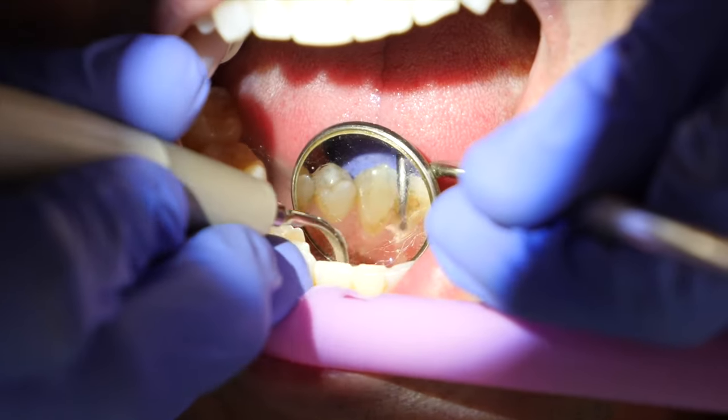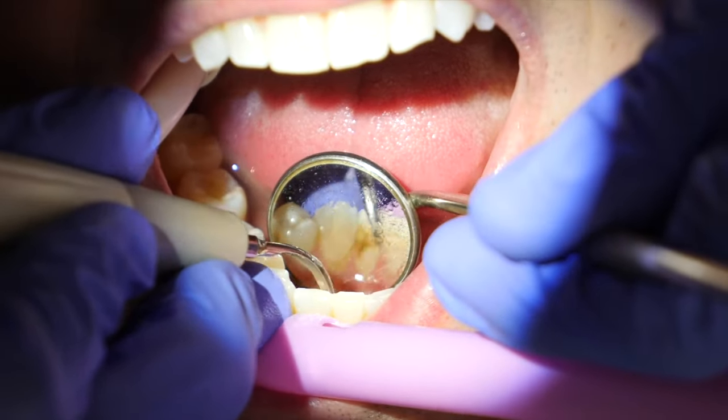Some people are concerned about the frequency and the vibrations, and if it can puncture through a tooth. When a licensed dental professional is using an ultrasonic scaler, we know which frequency to use for which procedure, so we would never put it on a high enough frequency to damage anything. Also, it's not a drill — it's not designed to puncture a hole through your tooth or drill through a tooth.